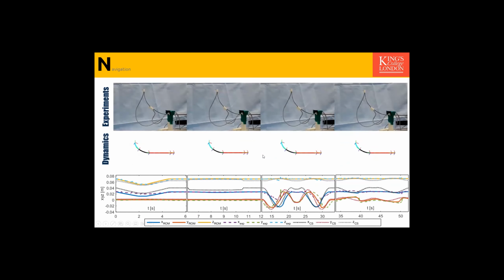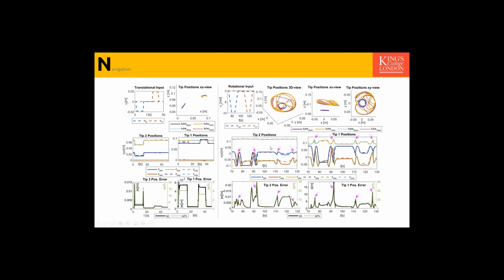The other thing that resulted in the videos not being properly synced is the backlash in the actuation unit. So we had in this specific robot between 5 to 15 degrees backlash when the motor started to rotate backward, and during the snapping, basically the tubes jump at the end of the backlash. So that was another issue. Partly manually and partly by implementing an if-else function, we tried to overcome that. But again, in the error plots, you see that after snapping we have a bit larger error compared to before snapping, and also a sharp error. So during the snapping it wasn't that accurate.